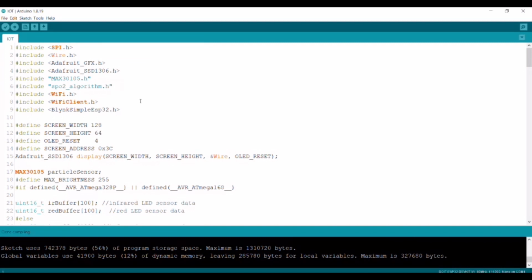For the coding, first we need to add the libraries here. This one is the library that allows us to communicate with the Arduino IDE. This one is for the I2C communication. This one is for the OLED. This one is for the MAX30102 sensor. And this one is for the Blynk application. And I define the OLED device here, as the screen has a width of 128, a height of 64, and the screen address is 3C.